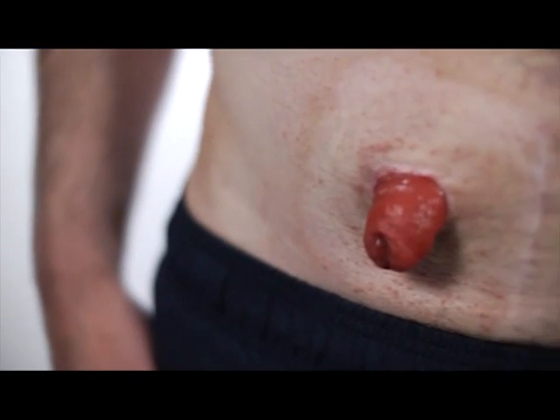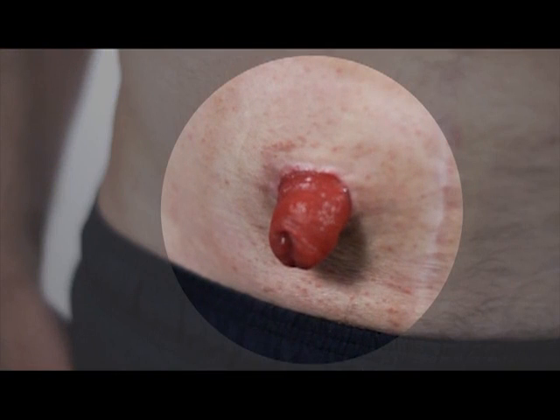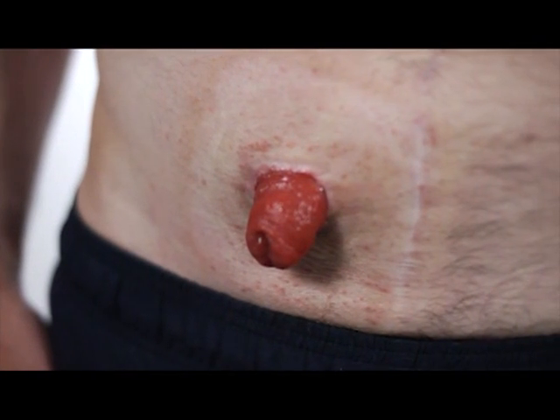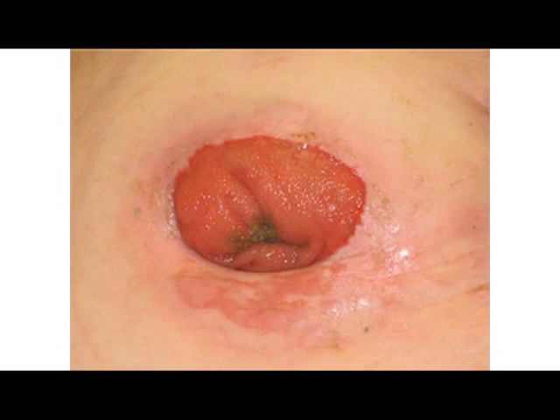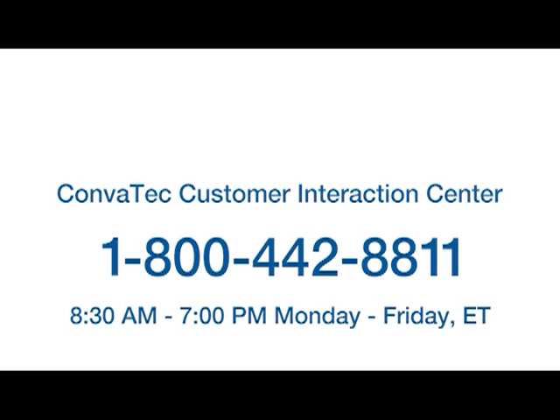The skin around your stoma, called the peristomal skin, should look and feel like the rest of the skin on your belly. It should be clean, rash-free, and not itchy. Your skin may be a little red after removing your wafer, but this is normal and should go away within several minutes. If the skin around your stoma stays red or has a rash, contact your doctor, ostomy nurse, or call the ConvaTec Customer Interaction Center.